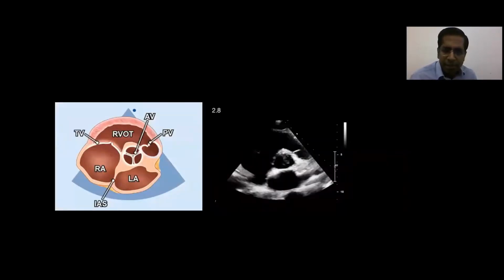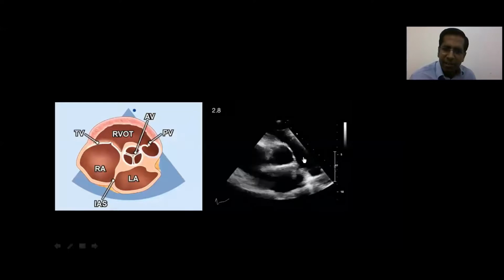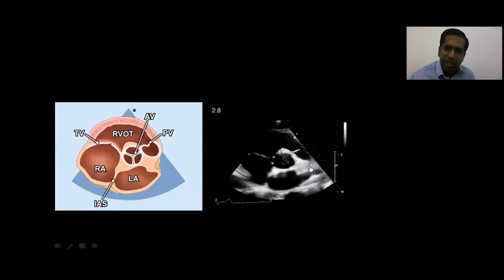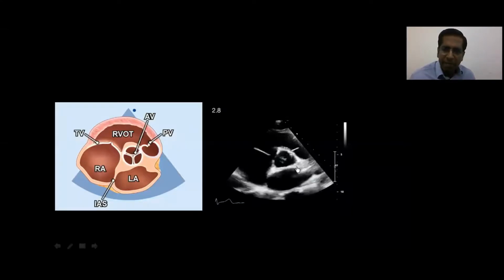This is again the same thing in a moving film. What I've tried to show here is that you can see this is not really coaxial, and this is really far off away. So a gradient that you take in this particular direction may not really be very accurate. You need to make that straighter, align that better, in order to get a better gradient.